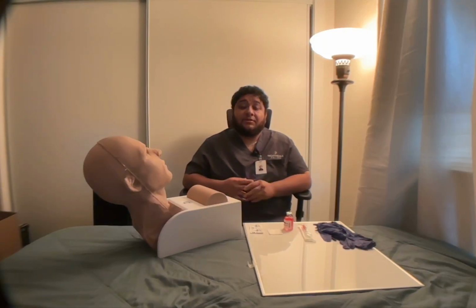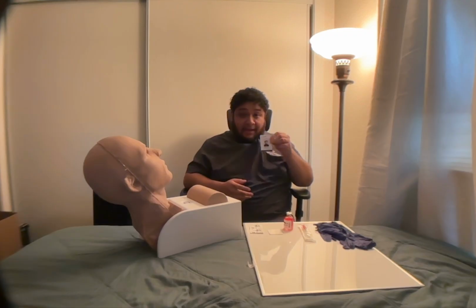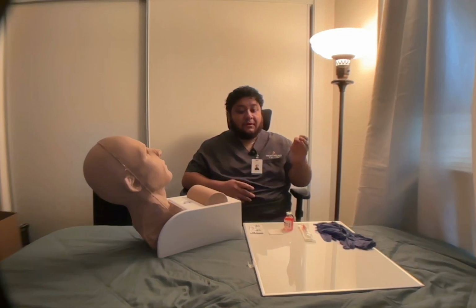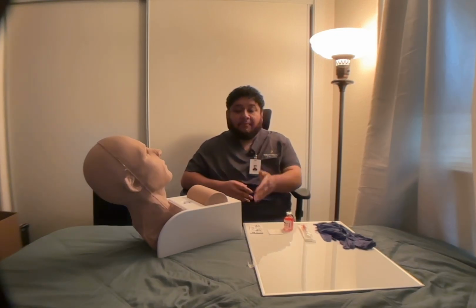Hello, my name is Christopher Jamie, and today I'm going to be demonstrating a subcutaneous injection. Here's my badge. These are my supplies. My supplies are going to be a clean set of gloves, my syringe, my medication vial, my gauze, and my alcohol swabs.